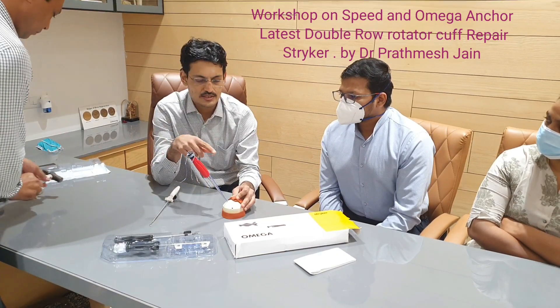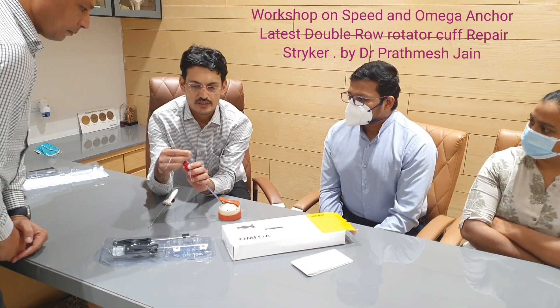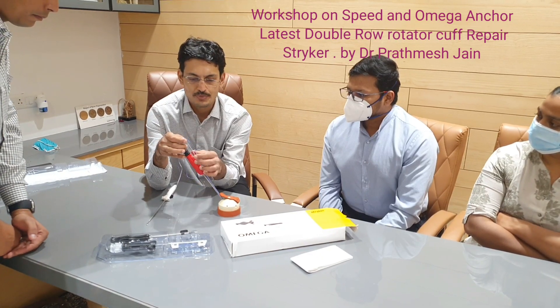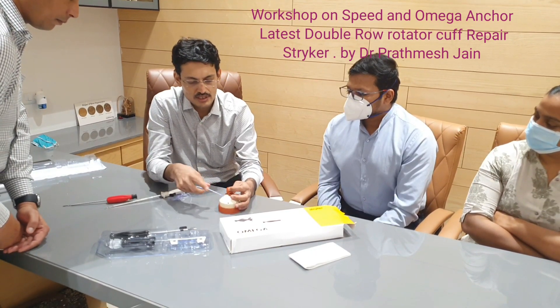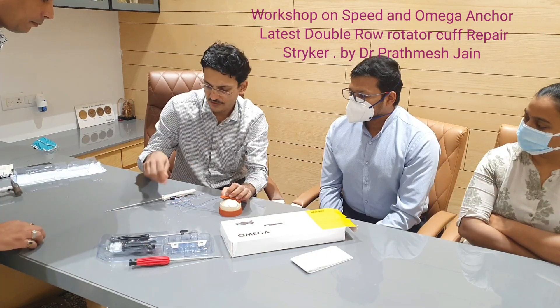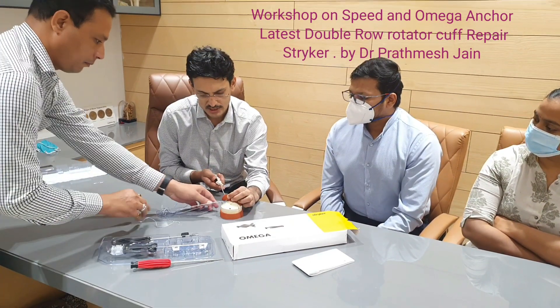This will go in easily — you don't need any separate inserter. It has a built-in inserter and it is loaded with two tapes, so those can be passed easily. After taking it out, all four tapes can be passed through the cuff tissue using any type of passing device, sequentially.